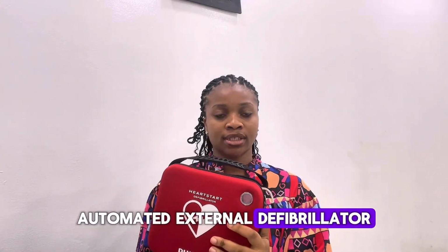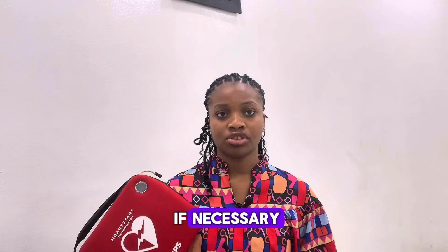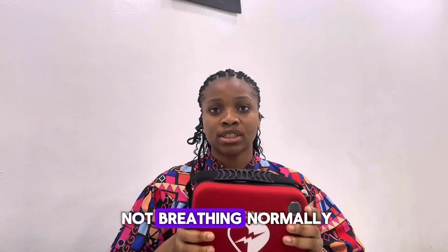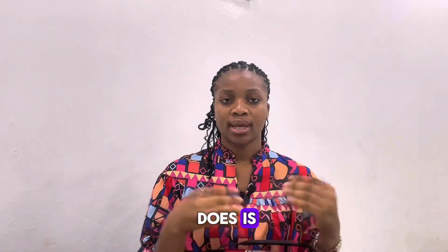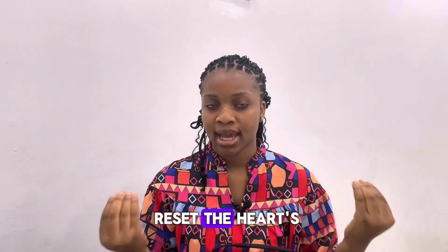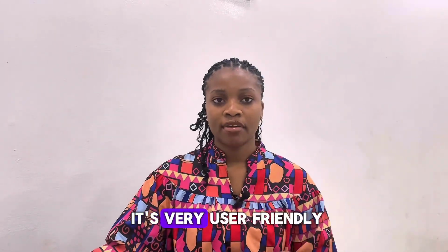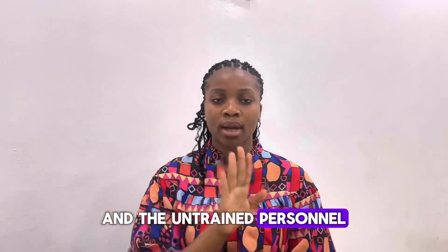As there is the AED, which is the automated external defibrillator. This is a portable device that analyzes heart rhythm and delivers a shock if necessary. It can restore a normal heartbeat in the case of sudden cardiac arrest. When the person is not breathing normally or is not responding to verbal command or physical stimuli, we make use of this AED. So what this AED does is it detects an abnormal heart rhythm and then it delivers a shock to reset the heart's electrical activity.